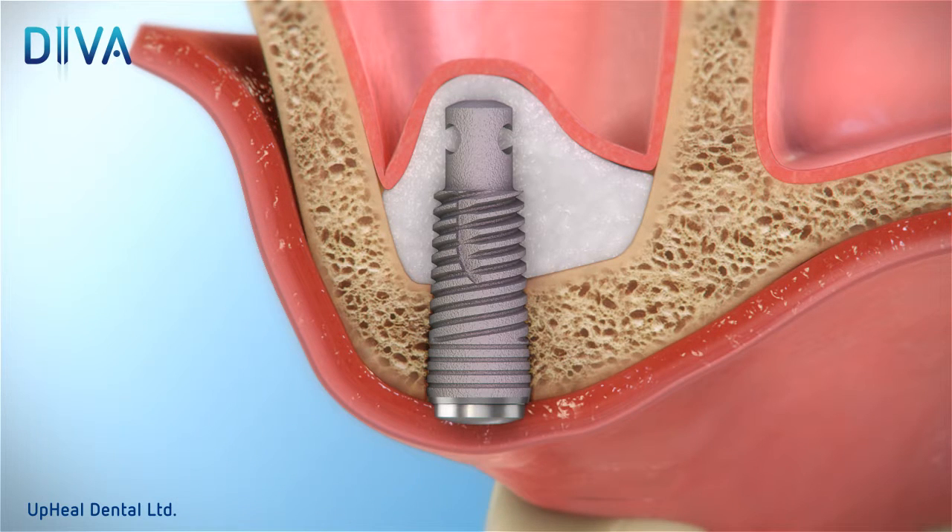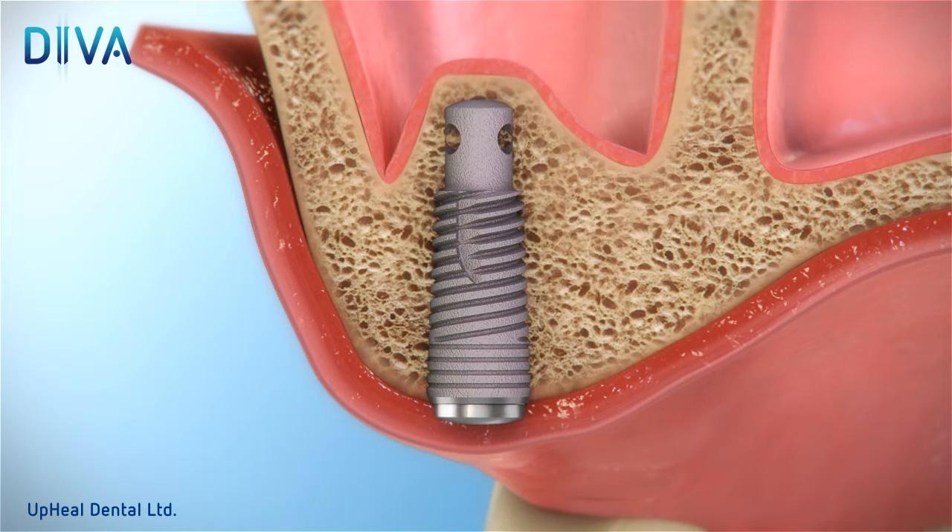After a 6 to 8 month osseointegration period, remove the cover screw to expose the implant and confirm that the inner valve screw is tight. Then, cap the Diva device with a healing screw. The implant is now ready for permanent prosthetic restoration.